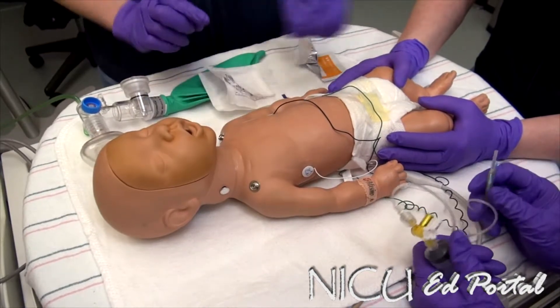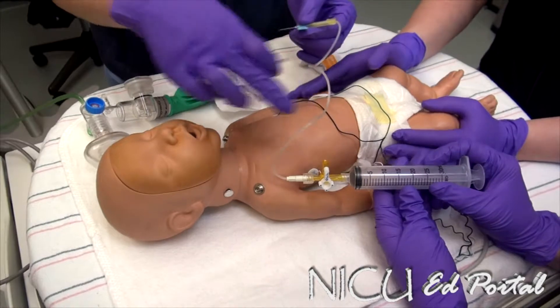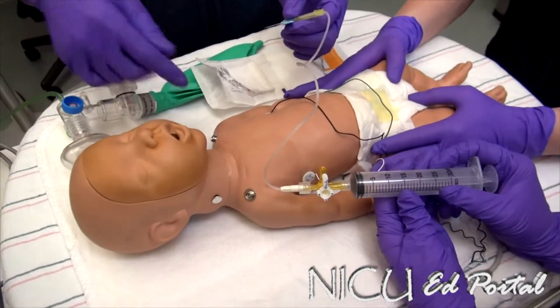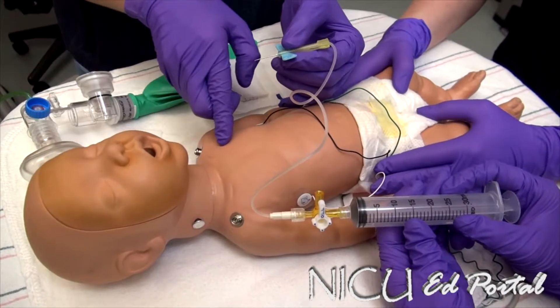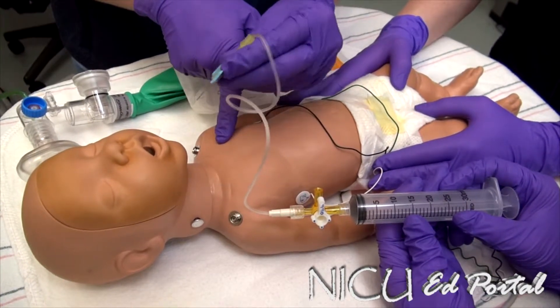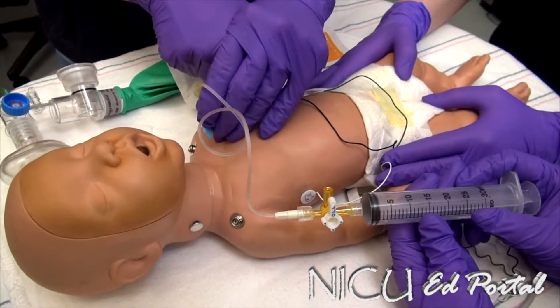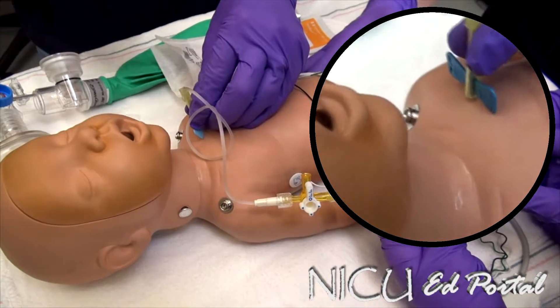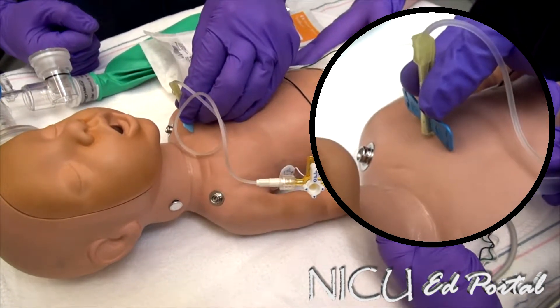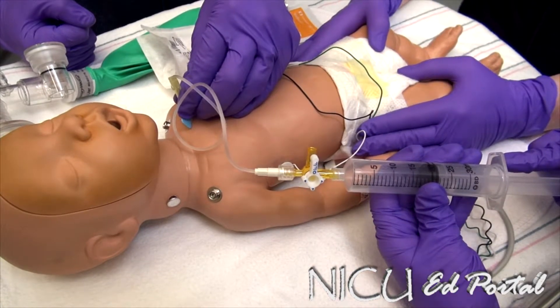We've cleaned our area and prepped it. We take our needle — open to the baby and to the syringe. Mid-clavicular, come down to the second intercostal space, and enter the space at a 90-degree angle. Go straight in. Then you can pull off air. As you pull off air and evacuate the pneumothorax, you will start to meet some resistance.